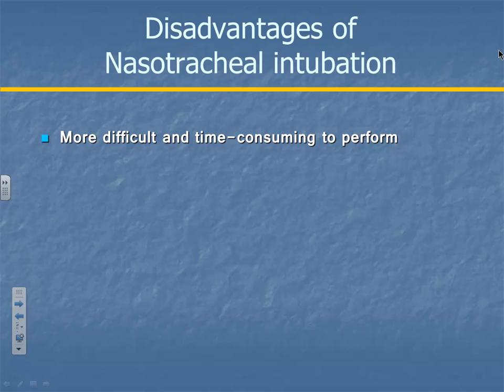One thing about this is you do it while the patient's breathing, so you're not going to interfere with their breathing until you put that down the trachea, then you're going to start ventilating. Otherwise, you're not really interfering with their breathing like you would in an oral. That freaks them out. I have here that it's potentially more traumatic for a patient.